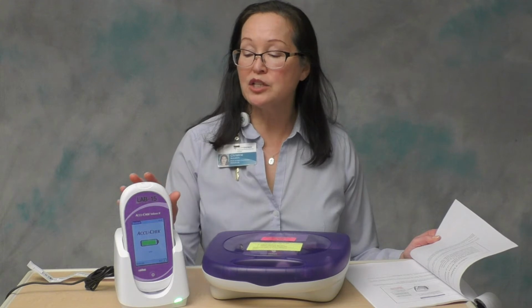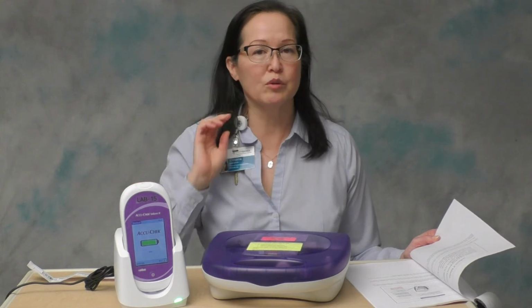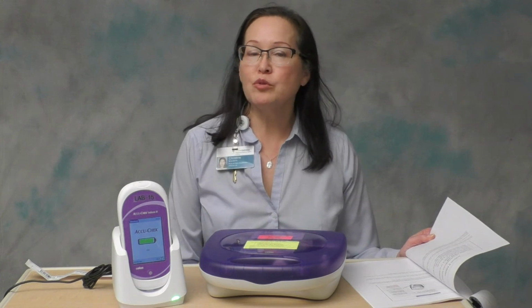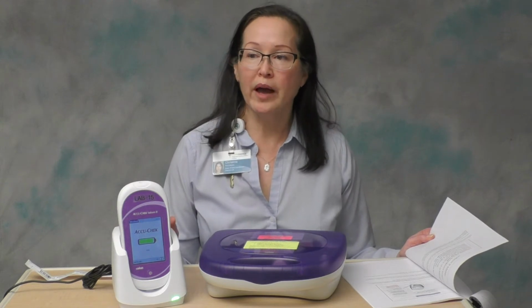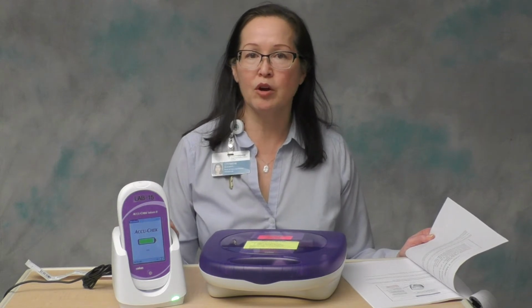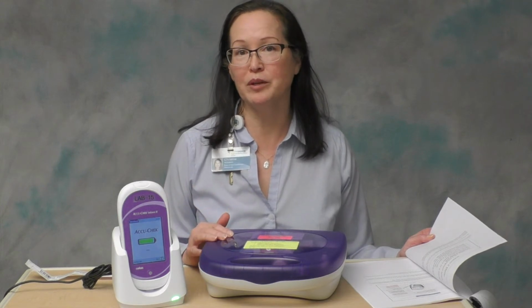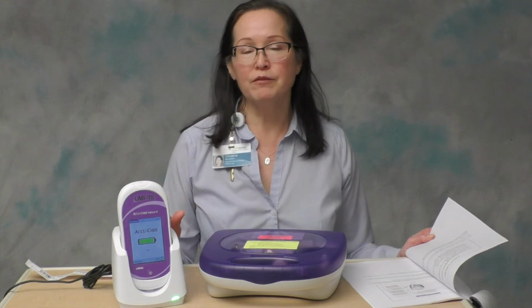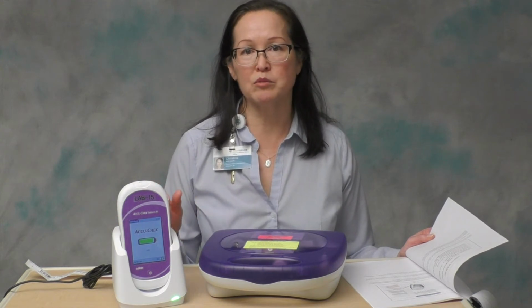We have a quick reaction time to your result. It should take less than 5 seconds for the instrument to show you the result. We have wireless transmission of the results to the patient's chart in Epic. We also have it wired through the base. There are a couple of units where the wireless transmission can be a little bit spotty. So if your wireless is not working well, you can always dock it and that will transmit the results through the network.